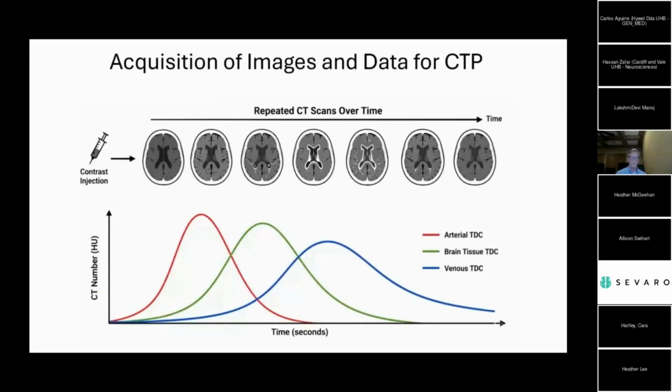So this image is going to take the place of like an hour-long lecture, so kind of bear with me here. How they acquire the images, and this is a modification of an image I got of a Canon product. Anyway, so you place the patient in the scanner. The technologist will then select the scanner range. Again, you have 4 through 16 centimeters of coverage.